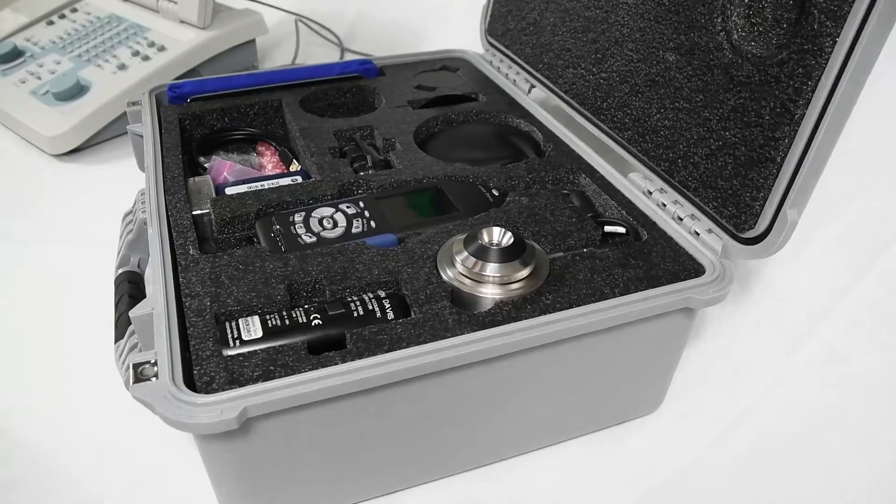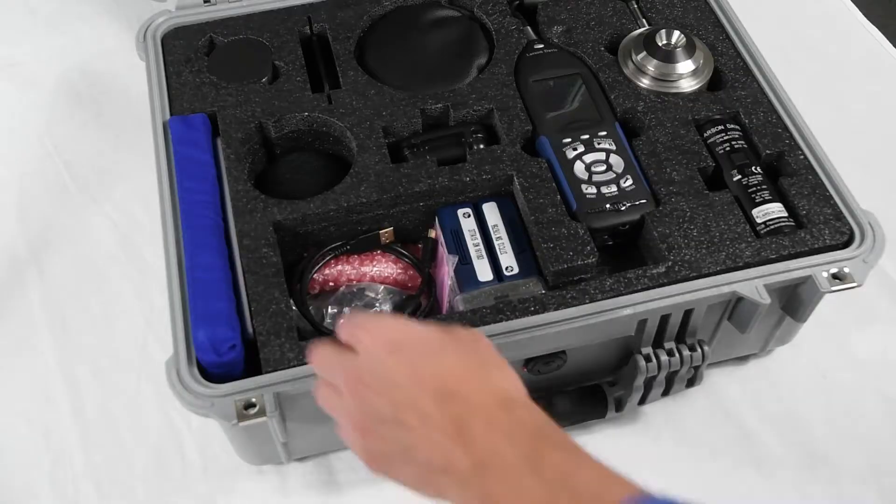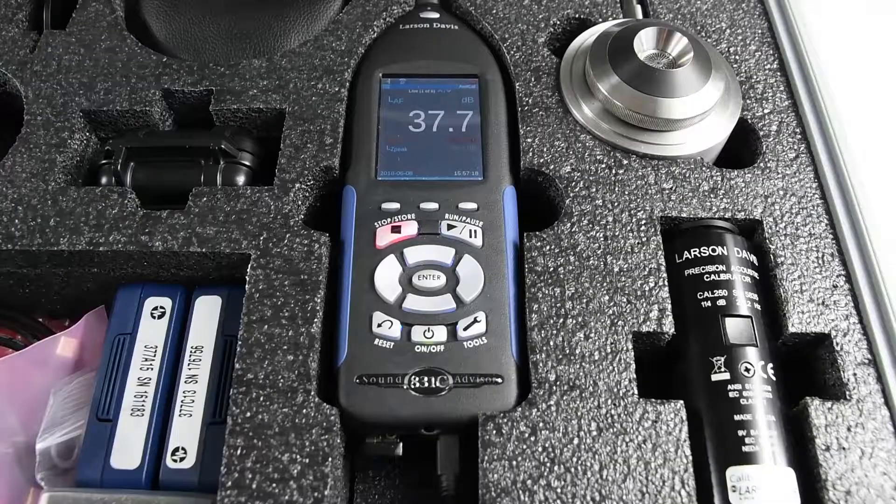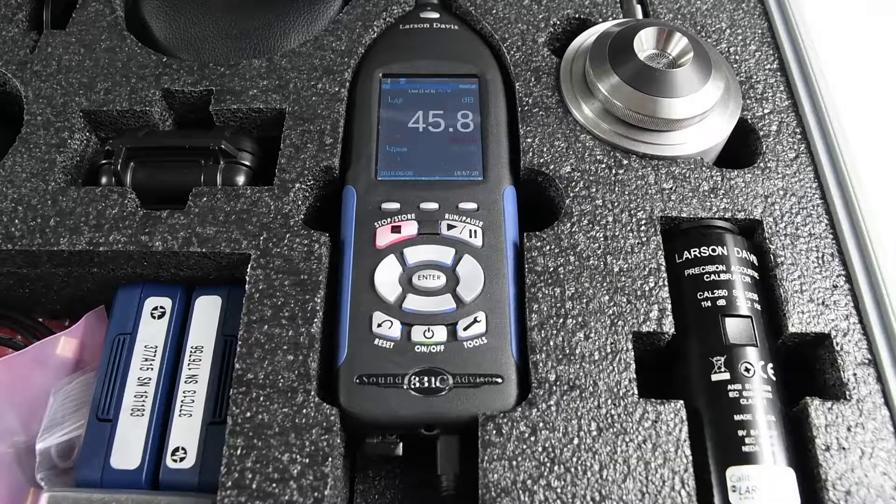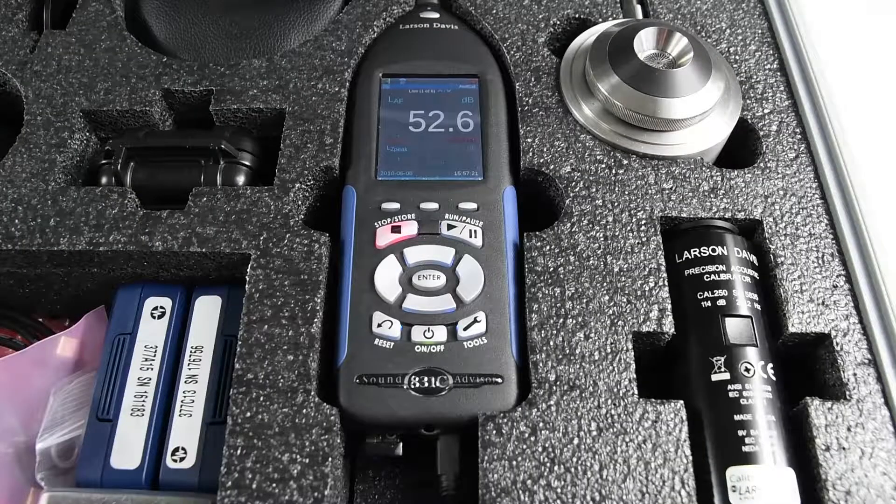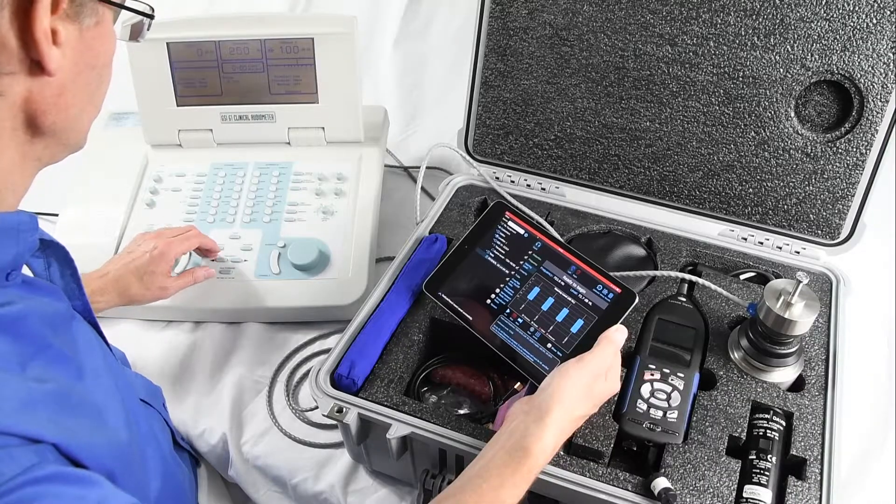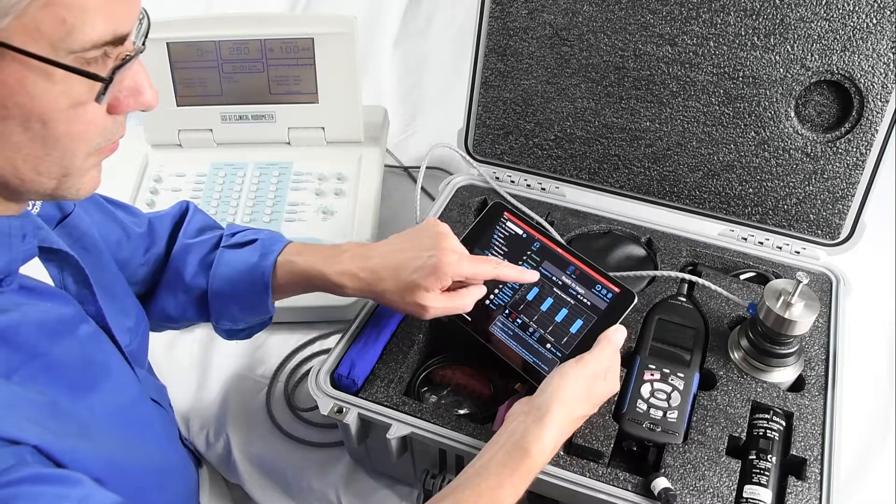AudCal is a system for testing audiometers. The SoundAdvisor Model 831C sound level meter measures the frequency and DBHL from the audiometer.